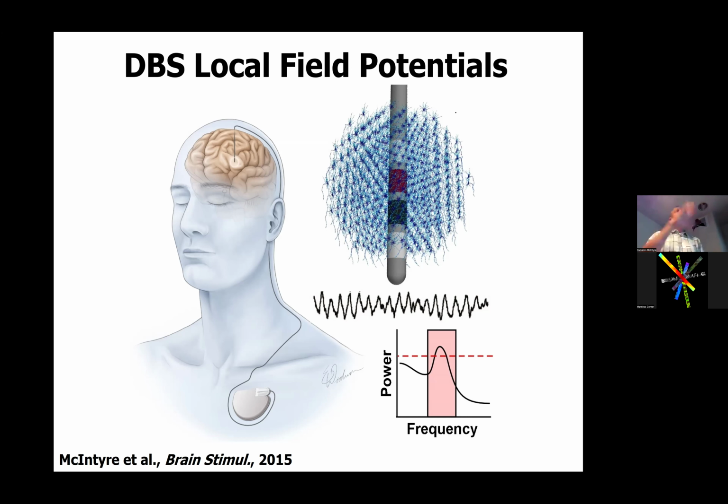Like I said, about 15 years ago, people got hot on this idea that you could do closed loop, electrophysiologically triggered clinical deep brain stimulation for Parkinson's disease. Then about 10 years ago, clinicians started having devices that they could prototype that kind of thing. And then 5 years ago, that became widespread.